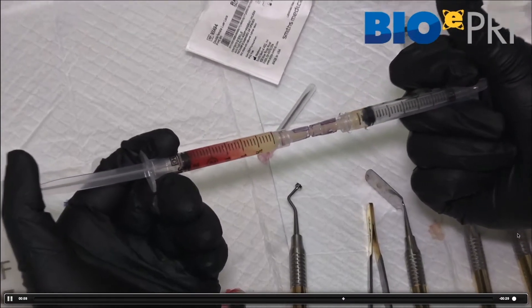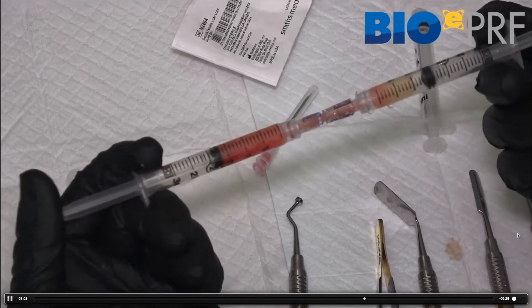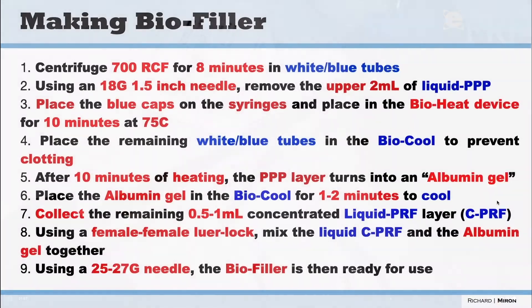Now making the biofiller — these are protocols that are used in facial aesthetics. This is when we want to heat the plasma, so now we're going to include the bioheat technology within these steps, and there's a little bit more to do here.